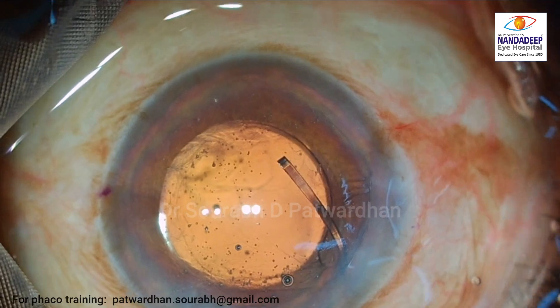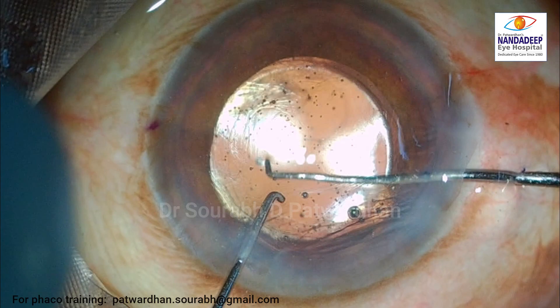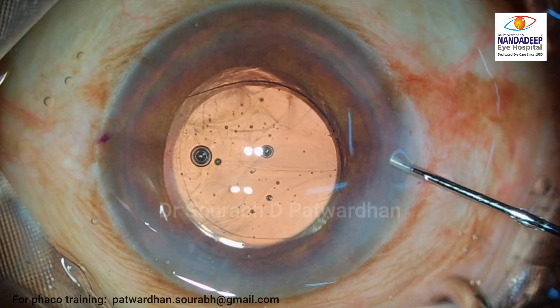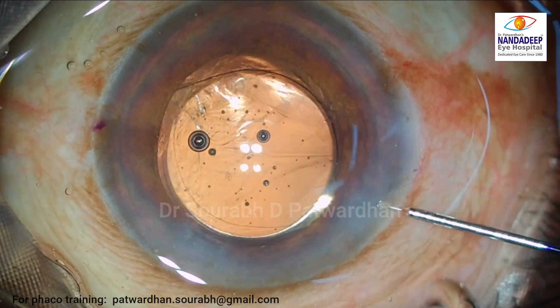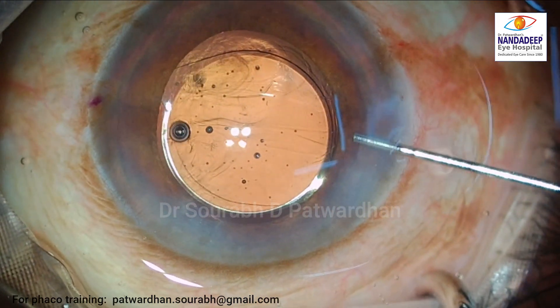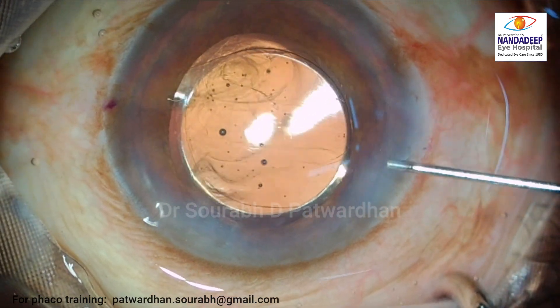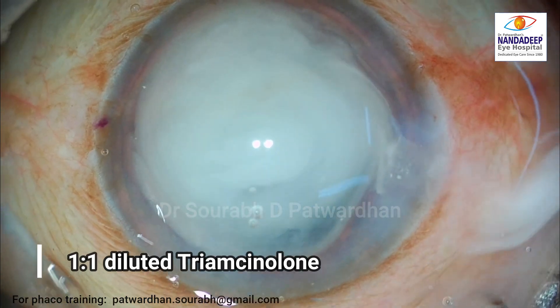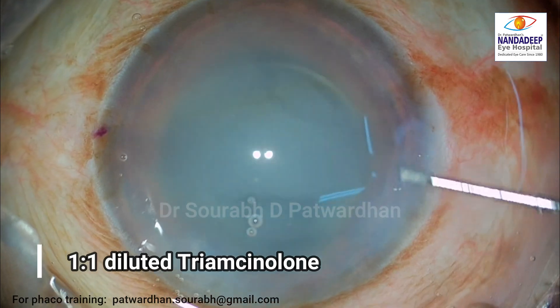The same bimanual maneuver is repeated for the trailing haptic, and now the IOL is nicely resting in the bag. I prefer to do a passive visco wash rather than putting the irrigation aspiration probe inside, because using high bottle height and higher irrigation pressure may itself damage the anterior hyaloid. This is the diluted triamcinolone which I injected to check for any residual vitreous — which is not present in this case.